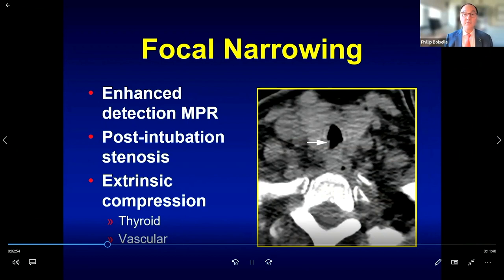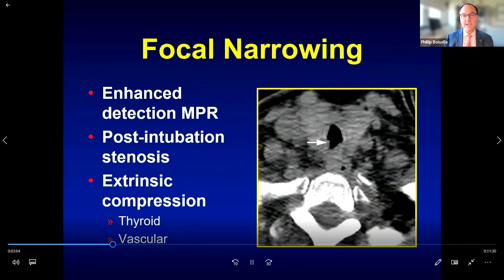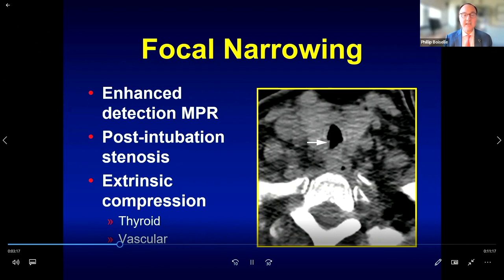Narrowing of the trachea can be either focal or diffuse. Focal narrowing can be difficult to fully characterize on axial images alone, so consider coronal reformation images in cases of known or suspected focal narrowing. One common cause of focal narrowing is post-intubation stenosis. Also importantly, think about extrinsic causes such as an enlarged thyroid gland or vascular structures.